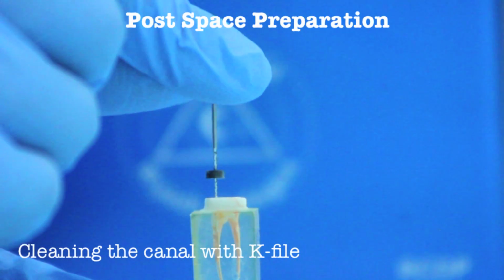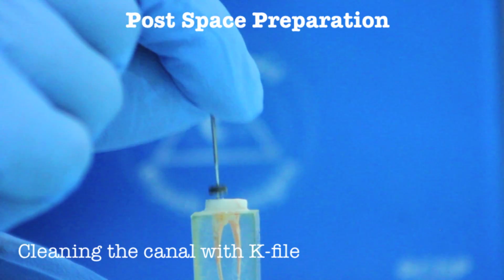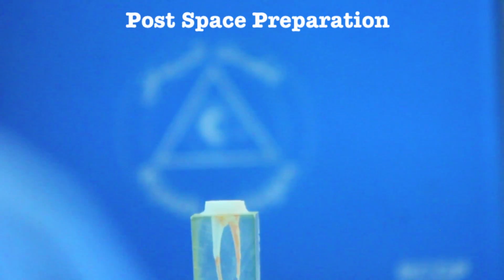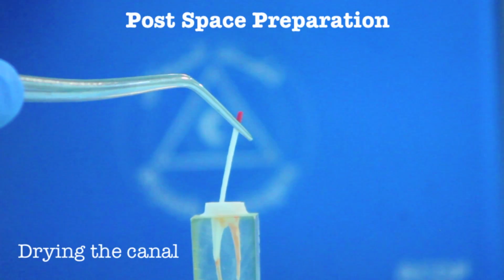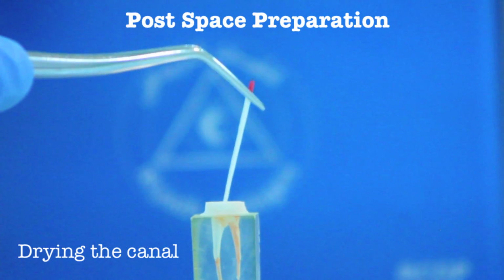With a K-file, clean the walls of the canal to eliminate any remaining gutta-percha, sealer, and undercuts to gain smooth walls which will facilitate building the post later on. Irrigate the canal well with normal saline and dry it using large-size paper points. Another radiograph is taken to evaluate the post space preparation before proceeding with pattern fabrication.